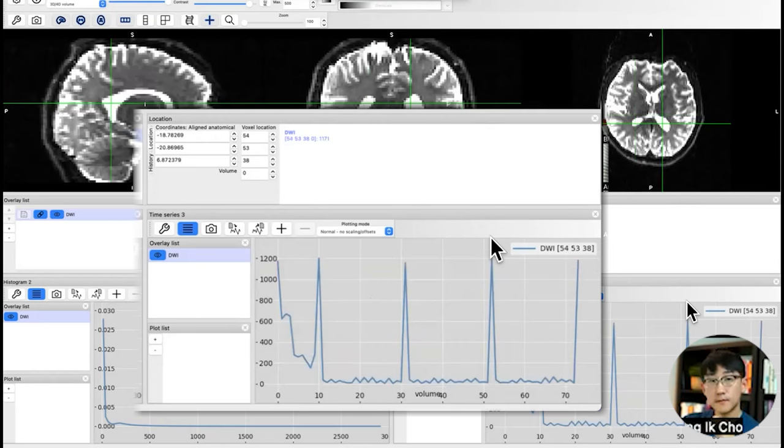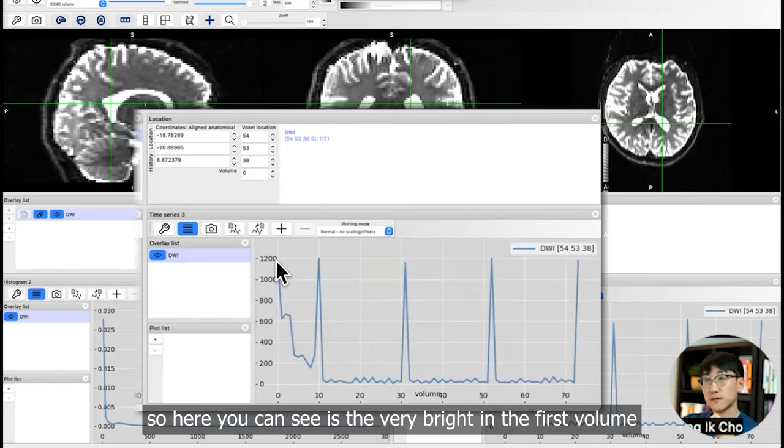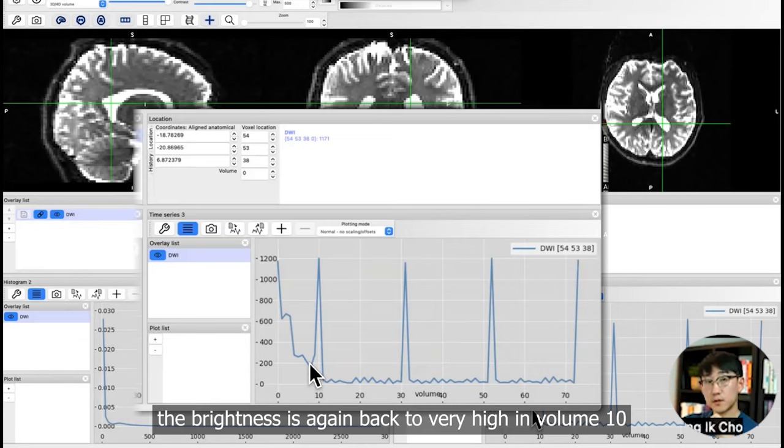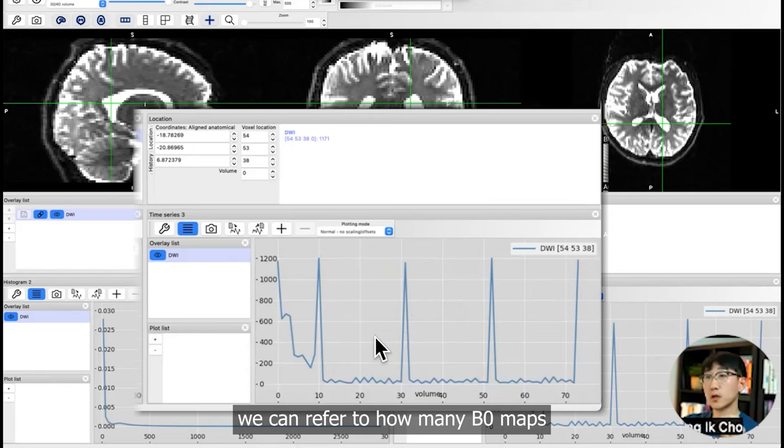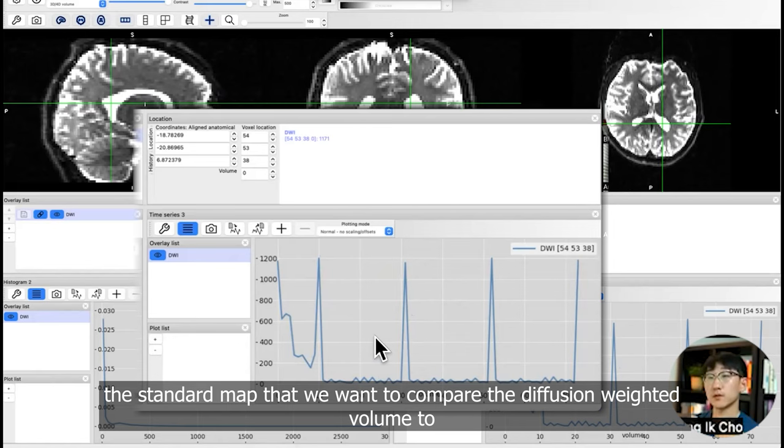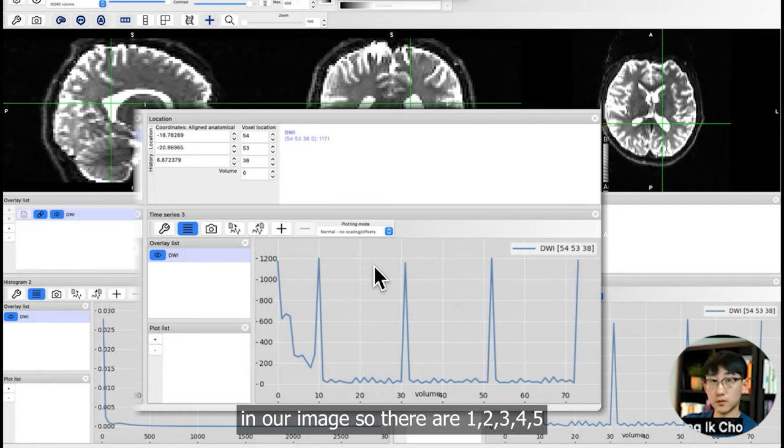Let's go to CSF. Here you can see it's very bright in the first volume. Then the signal attenuates. The brightness is again back to very high in volume 10 and volume 31, a few times across the volume.